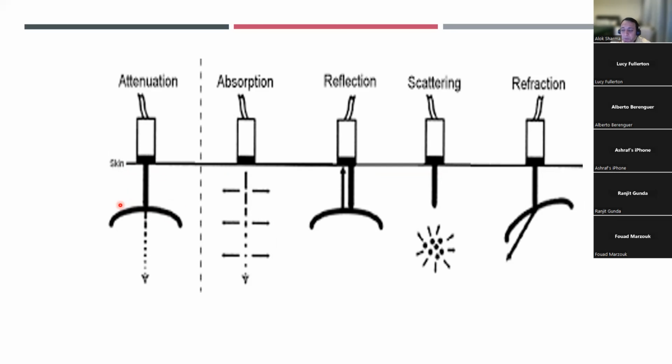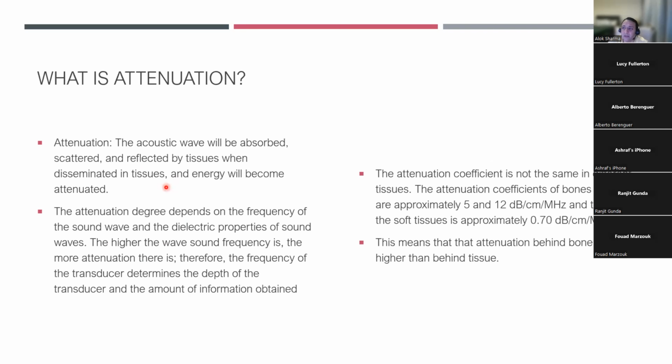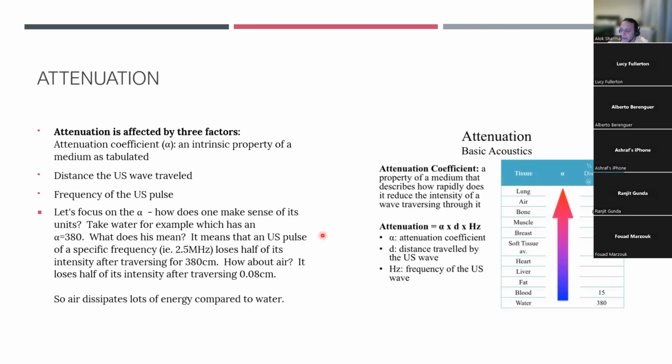On the other hand, if I've got a term baby, what I want to do is see tissue that's much deeper down, that has to travel through much more superficial tissue, skin, fat. Really, I would be using a lower frequency probe so that the wavelength traveled is higher, so that I can actually see deeper into that lung tissue. And that's why attenuation is such an important concept. Now, what is important from our perspective is that attenuation, depending on the tissue you're going through, will be more.